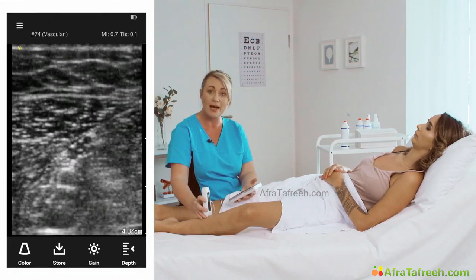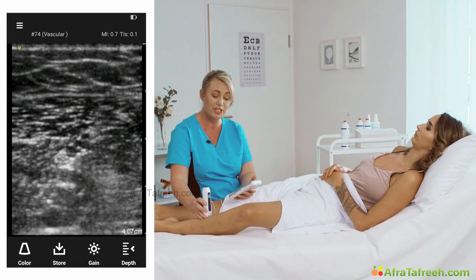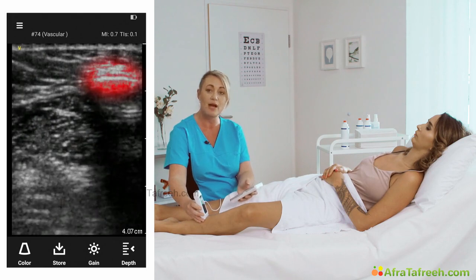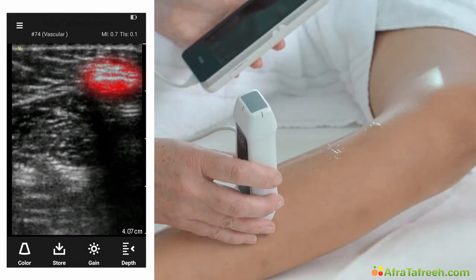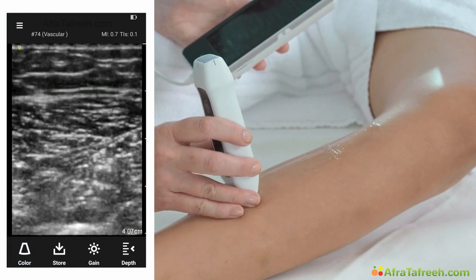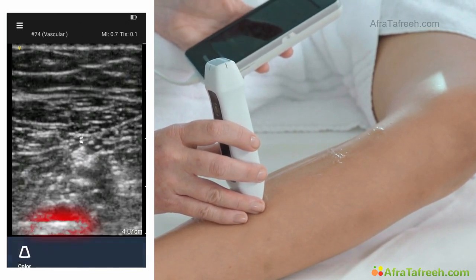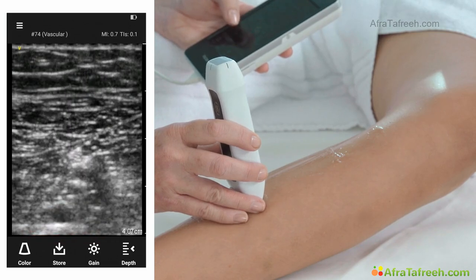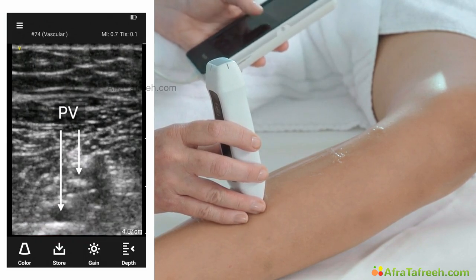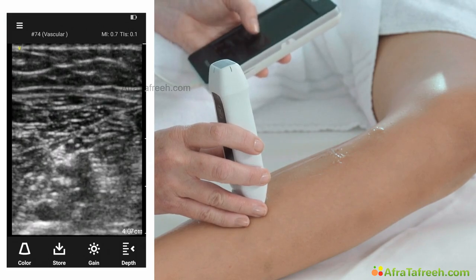So if we start mid-calf, some of the landmarks that I may use to find the veins, if they're not instantly appreciated, is to scan towards the tibia, which we can see here on the right of the image, the echogenic bony cortex with a shadow behind. Then we're going to slide slightly posteriorly and we'll identify the fibula at the lower part of the image. Our peroneal veins are paired against the artery, so we see the two peroneal veins here deep in the image, and our posterior tibial veins are sitting closer to the transducer here under the fascial plane.